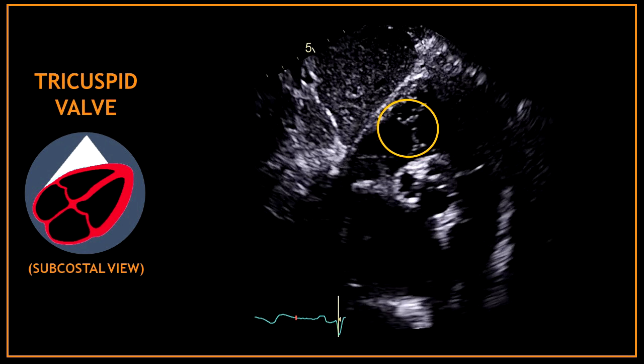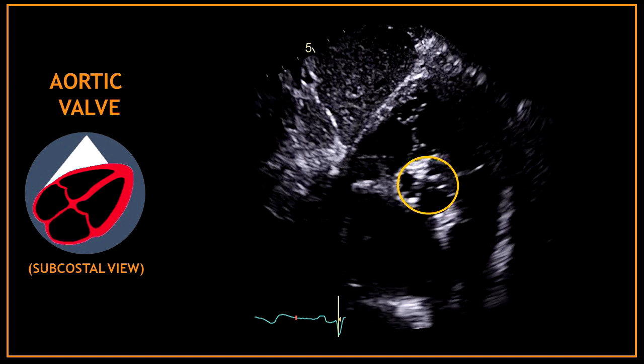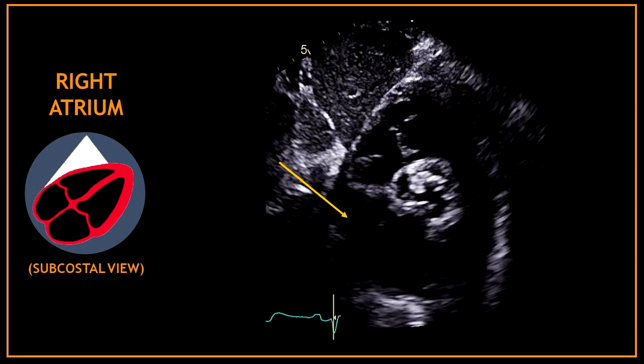The tricuspid valve is also easily visualized in this view, together with the aortic valve in the middle of the screen. Under the tricuspid valve we have the right atrium. Under the aortic valve we have the left atrium. Between both atria you can assess the inter-atrial septum.